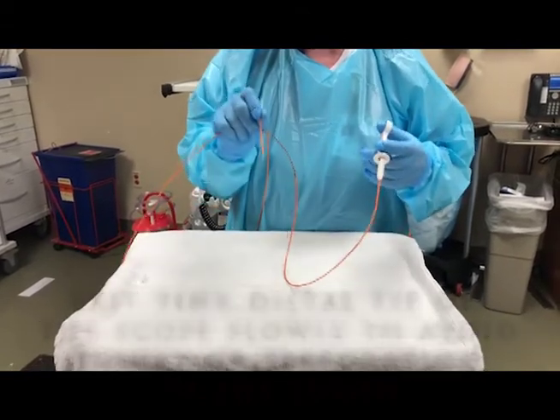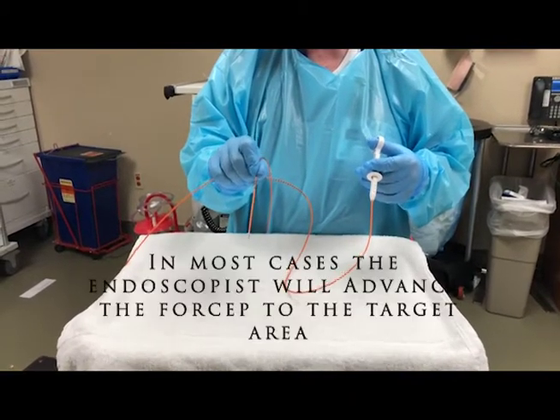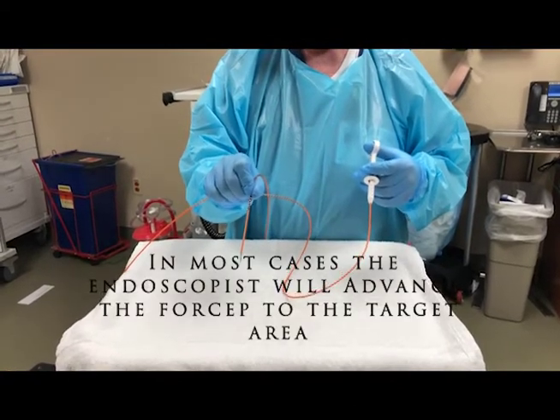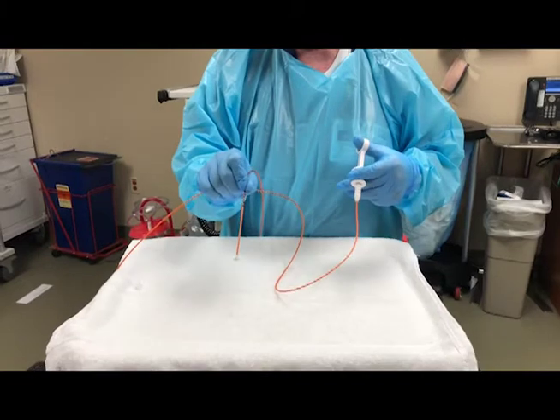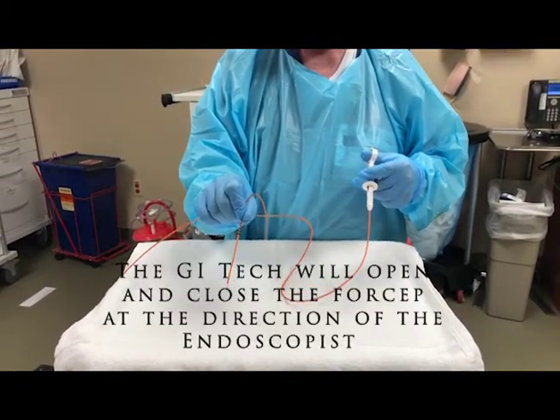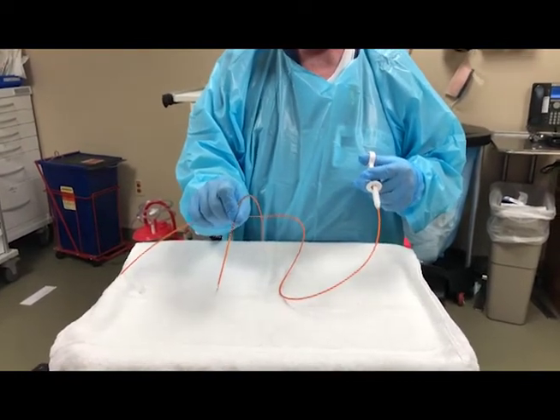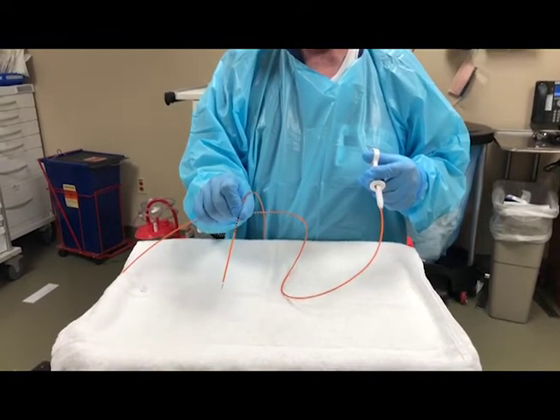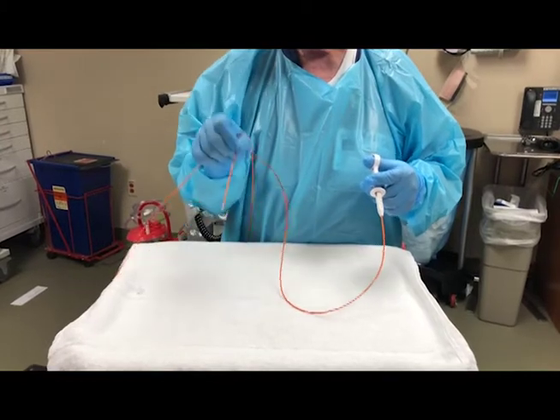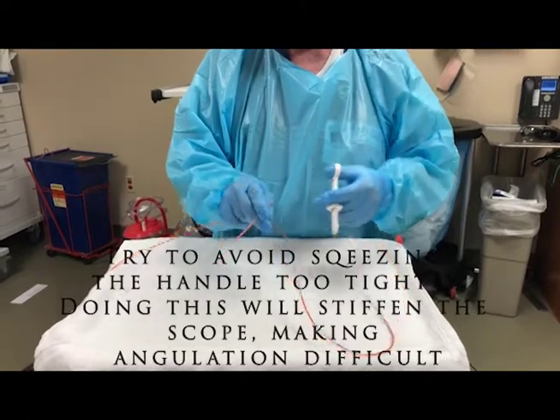At that point you're going to move the tip of the forcep towards your target area, then open it, then push into the target area and close. But don't close hard — close gently at first until you're sure you have the tissue you need or the polyp. Then the endoscopist will quickly pull it back.